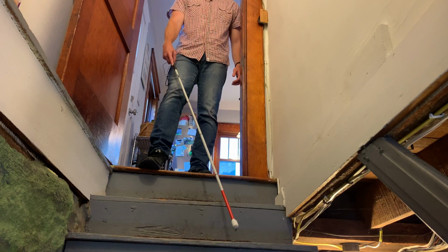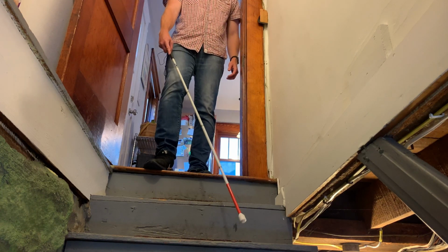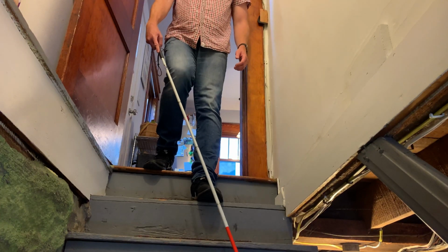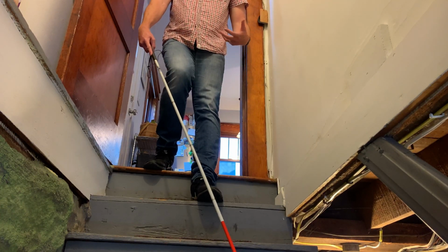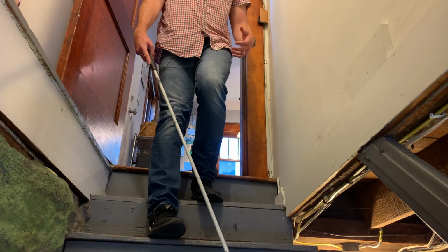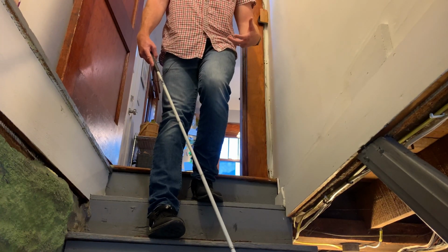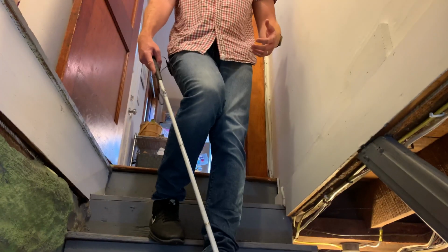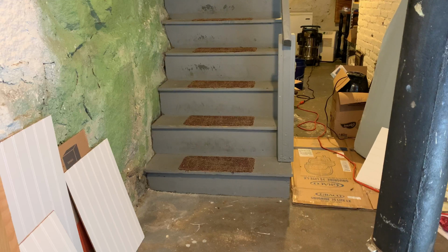So right now it's hovering over the first step. So I'm going to take my first step down with my left foot. My cane has now lowered and is hovering over the edge of the second stair. So now I'm going to step down with my right foot. Cane tip is hovering now over the edge of the third stair, and then I would continue down the stairs in this way.